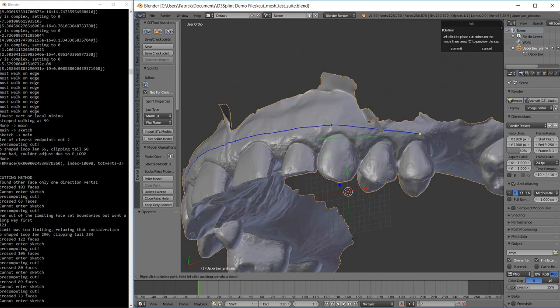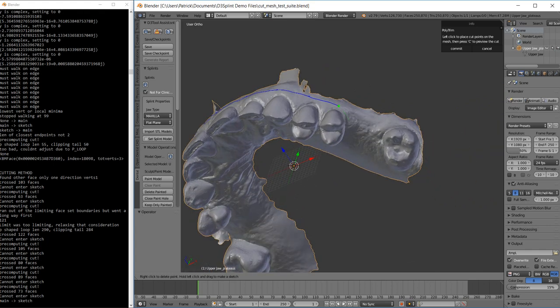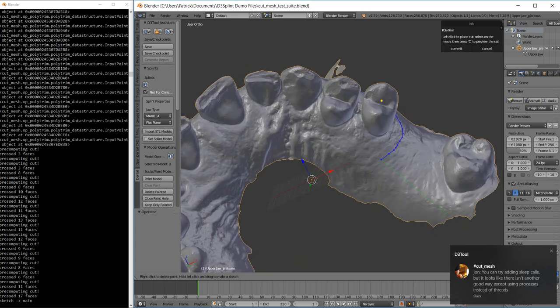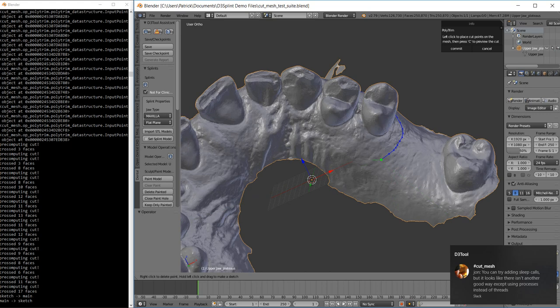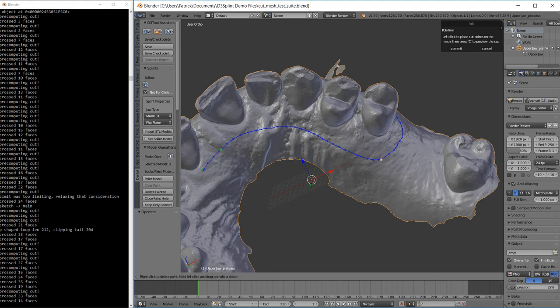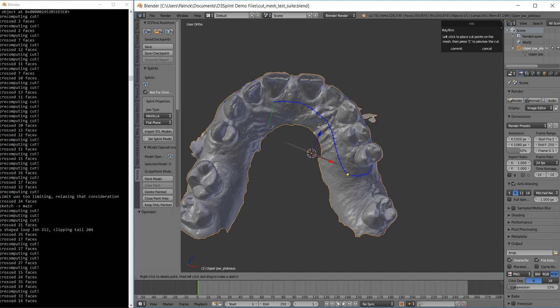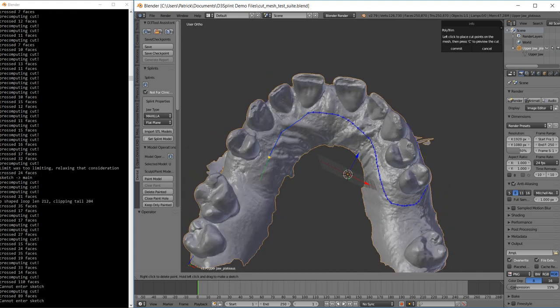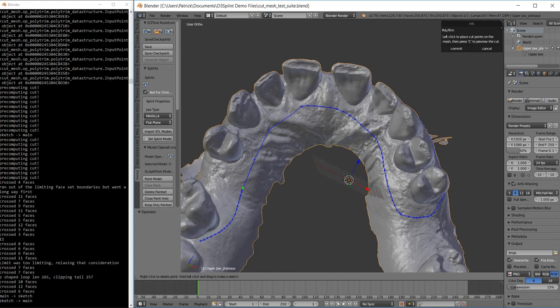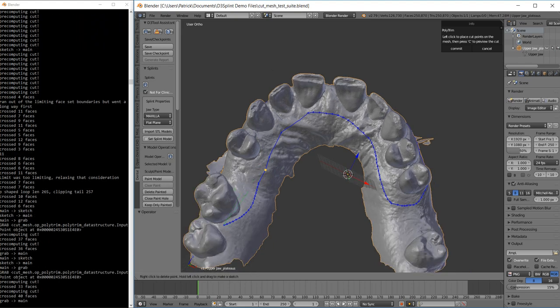We've got a good interface for really long, straight, precise cuts, and also a good interface for sketching. We need, oh, there's my developer right there. We need a little bit more smoothing adjustment, and we may adjust the resolution or how many points get sketched out here. But for the most part, if you want to make a very precise straight cut, you can. If you want to make a nice swooping cut, you can grab them, though we need to get a better widget interface.